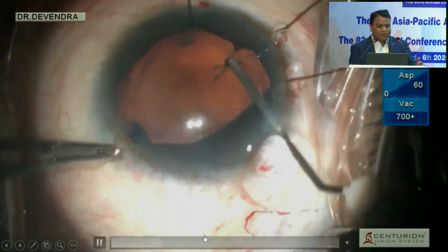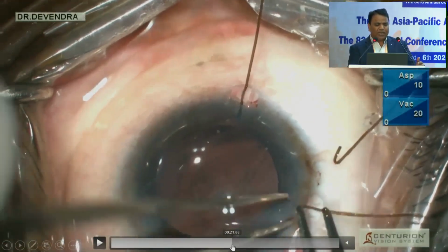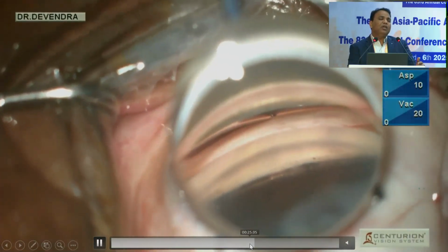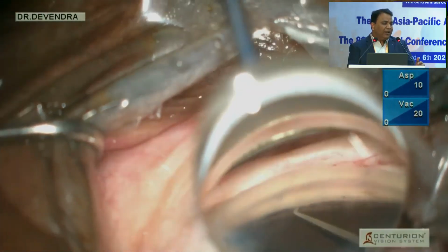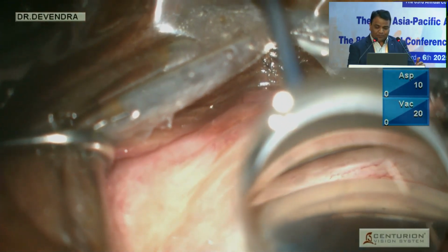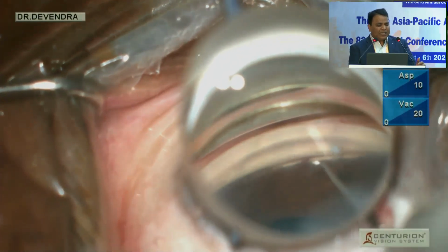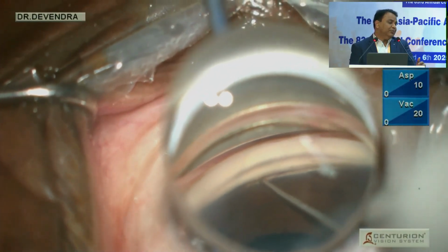So in such situations, usually with the Tanito, after completing the phaco surgery and placing the lens, you can perform the goniotomy so easily and simply. Really, such surgeries are a boon for such difficult scenarios, and you can get a very good outcome, especially in these challenging cases.